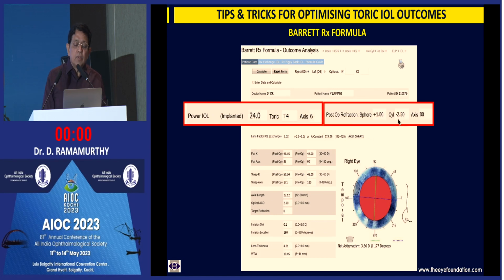One factor that you do need to understand is that rotation of these intraocular lenses will take care of the residual astigmatism only if the spherical equivalent of the residual error is almost zero. If it was just 1.5 diopters of cylinder, or if it was 1.5 diopters of sphere, rotation of this lens is not going to serve any purpose, simply because when you are rotating the lens, you are just redistributing the power and not introducing any extra power.